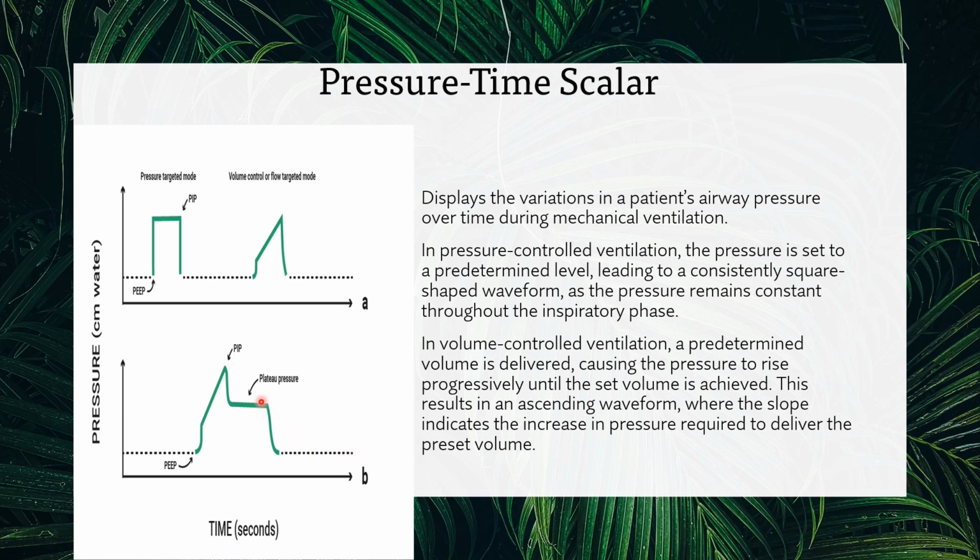Plateau pressure is measured during an inspiratory pause. This pressure, observed in the absence of airflow, reflects the amount of pressure needed to maintain lung inflation at the end of inspiration.